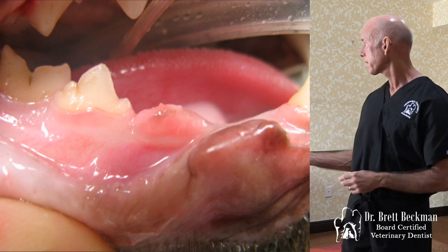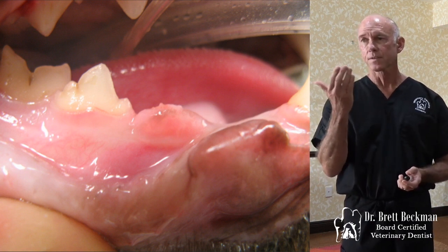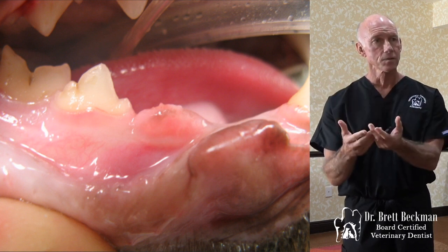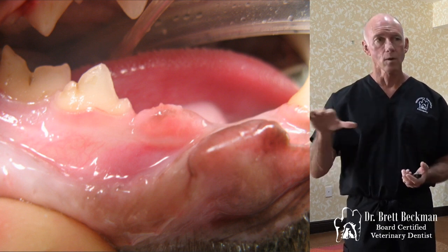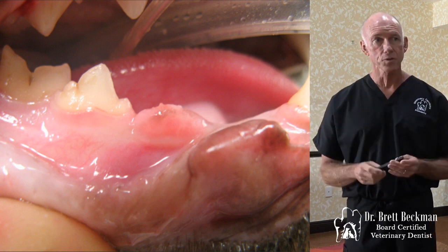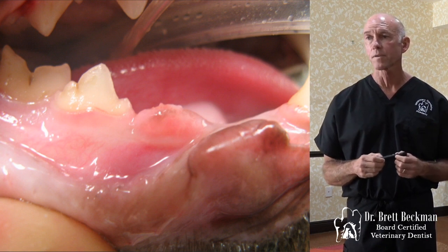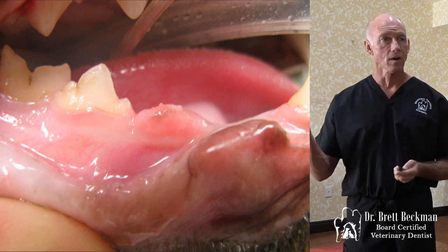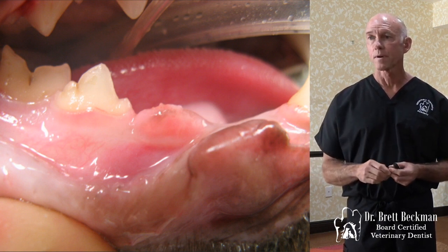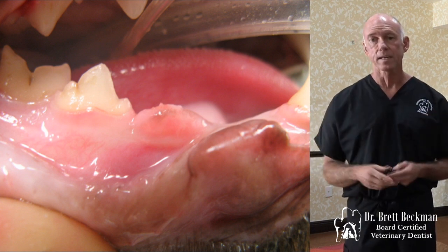But if it's inflamed, that means you've got some of that crown that's still there and causing inflammation under the gum line. It's extending to the epithelium. You want to go ahead and do a crown amputation, and in this case, usually it is a true crown amputation where you're going down to the marginal bone. You don't have to go much further, but not always, because we saw in that other patient, same tooth, just had to go a little bit deeper. But many times when you see this, it's just a crown amputation.